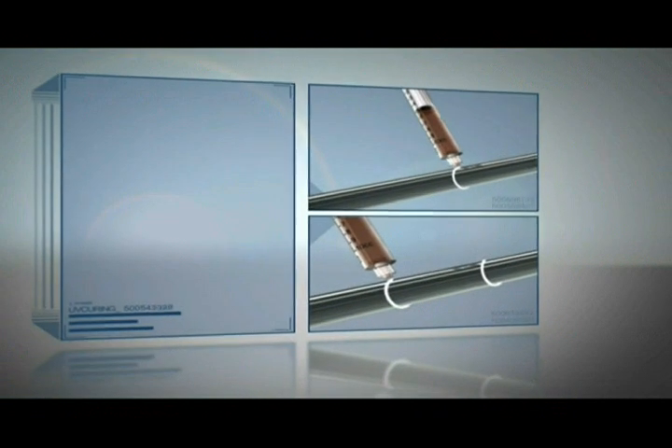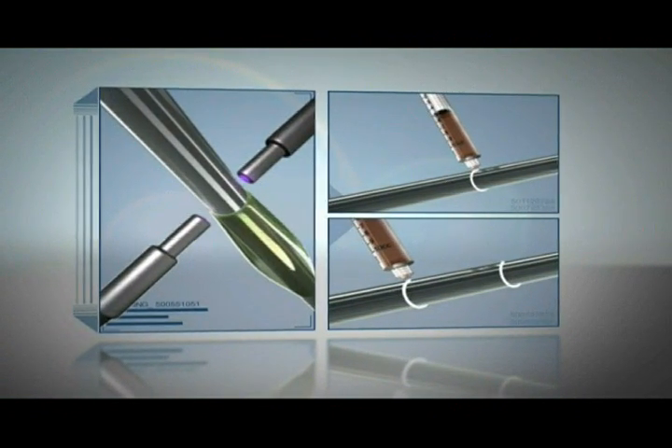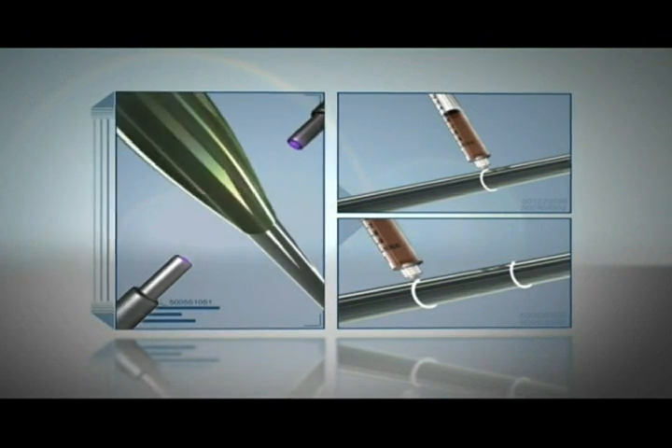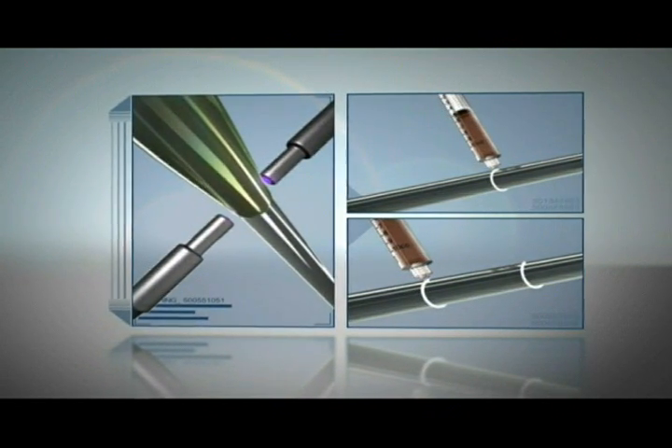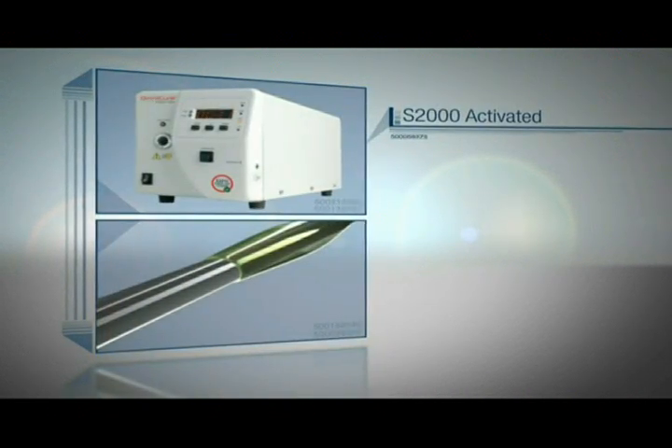The balloon is placed on the catheter. The high power fiber light guides are arranged around the catheter to provide a uniform 360 degree illumination of the bond line. The Omnicure S2000 is then activated to start light output.